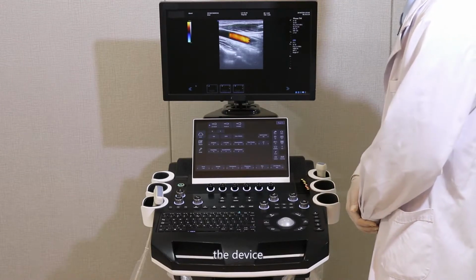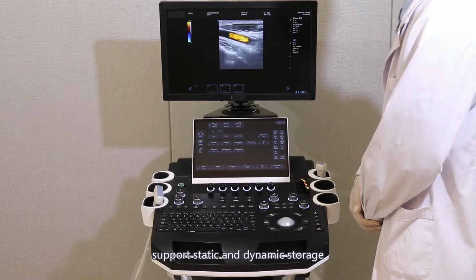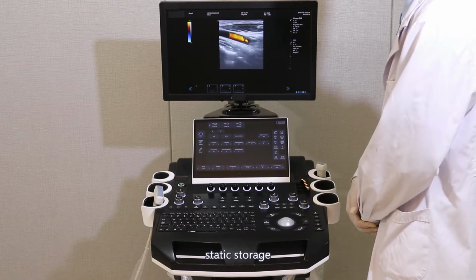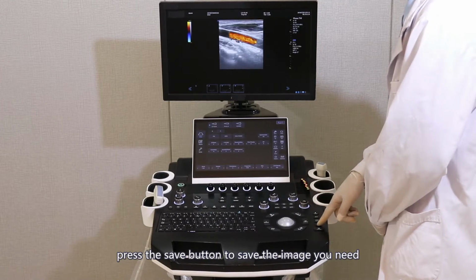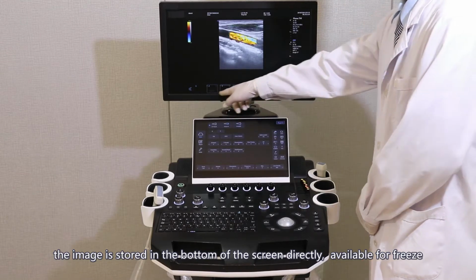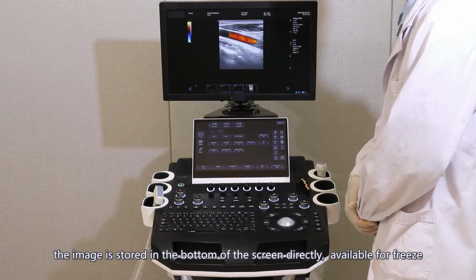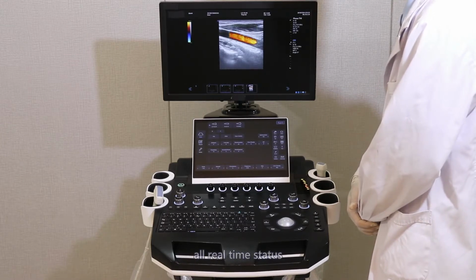Image save. The device supports static and dynamic storage. Static storage: press the Save button to save the image you need. The image is stored at the bottom of the screen directly, available in freeze or real-time status.